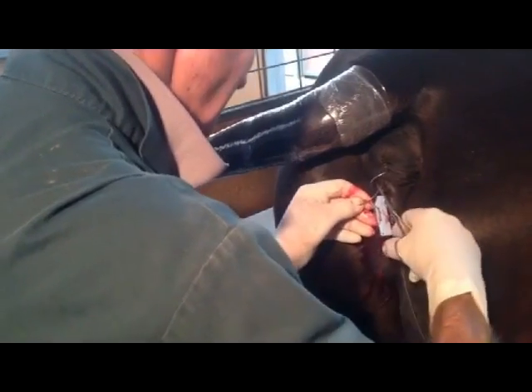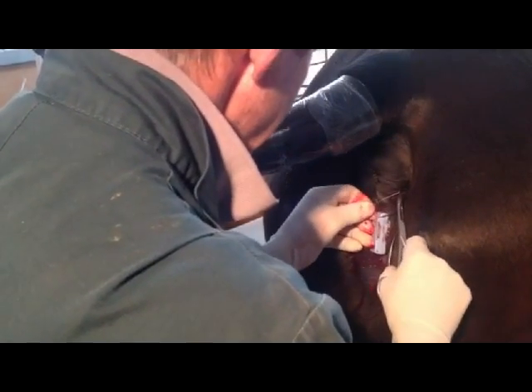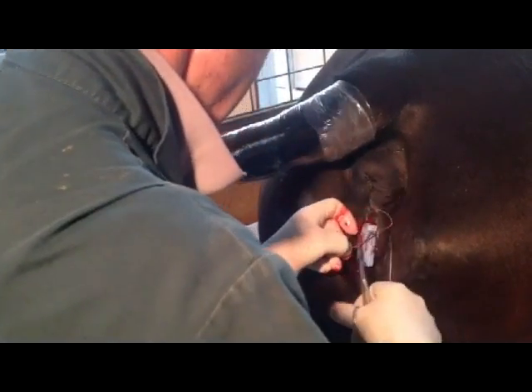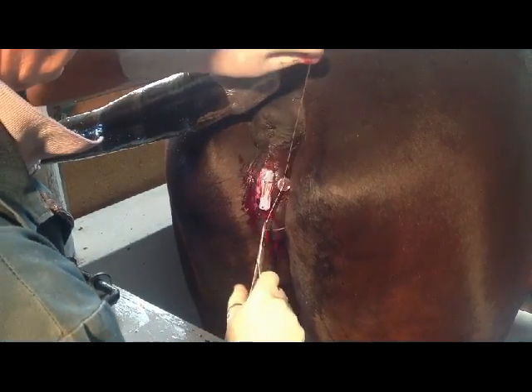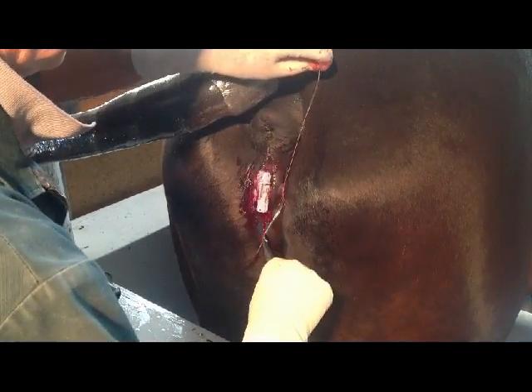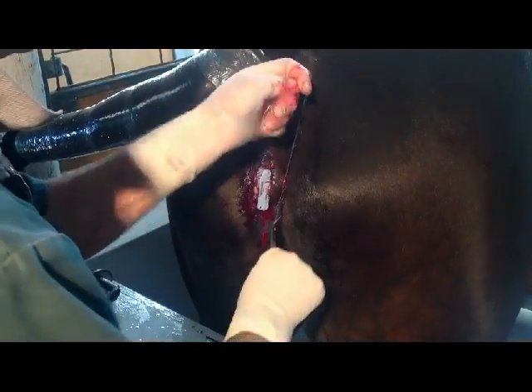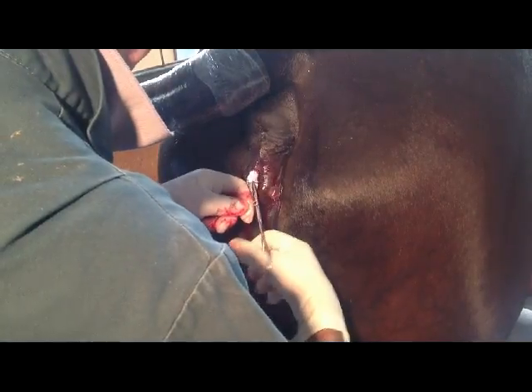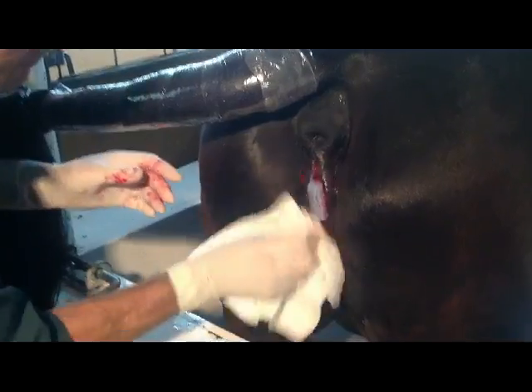The vet is pretty careful around sterilisation, and the mare has a local anaesthetic before. You can see by the way the mare's standing quietly that she's in no pain at all. That's just the finishing touches — putting that last button on, and that's attached across to that wee blue box. So when that circuit breaks, it activates. We put it fairly high up on the vagina so that the mare can urinate without any problems, and we find these don't agitate the mare at all. We attach them about five or six days before the mare foals.